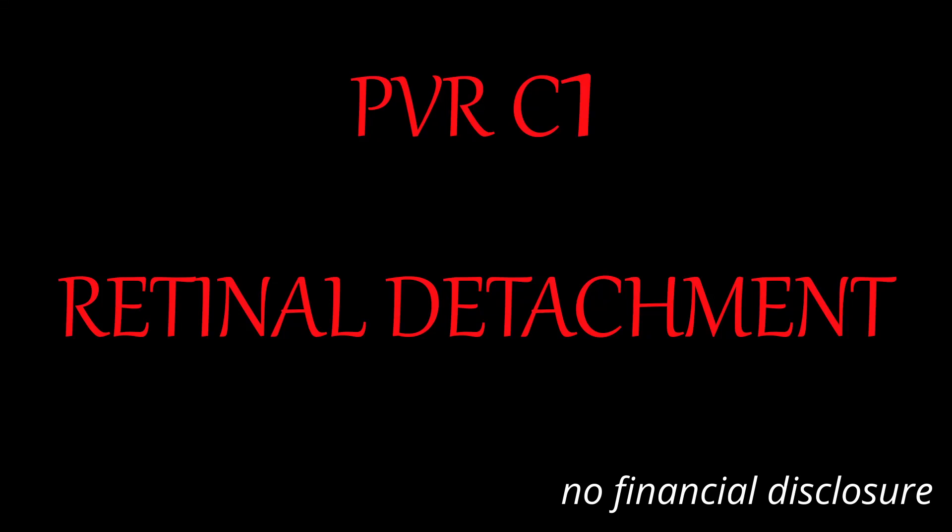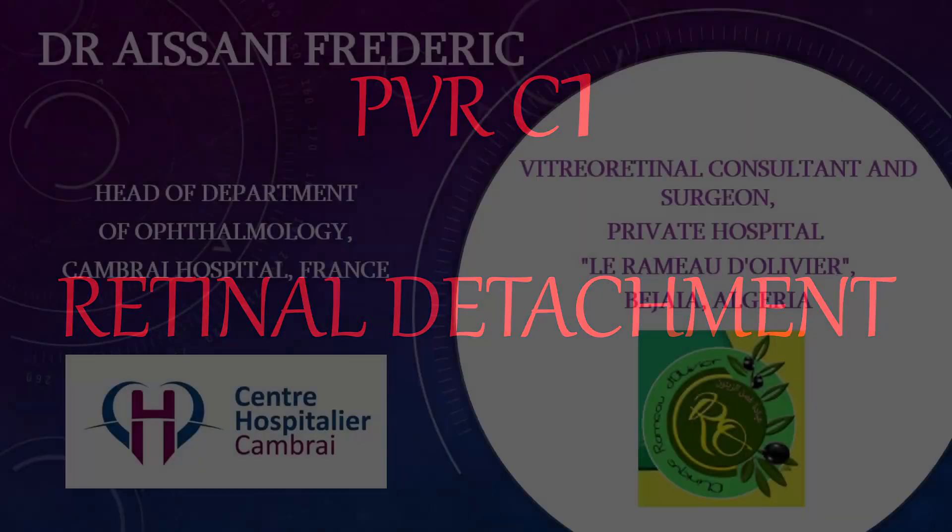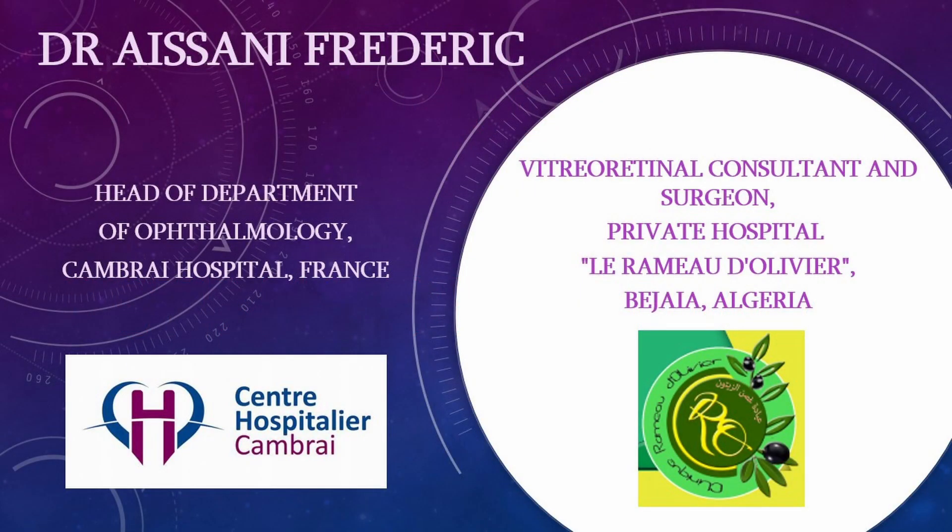Dear colleagues and friends, let me show you the video of this PVR C1 retinal detachment surgery performed by one of my fellows.